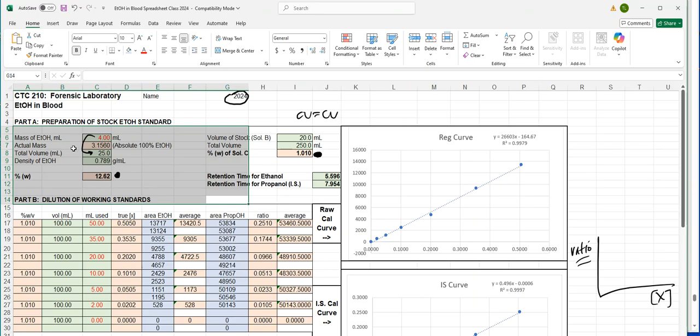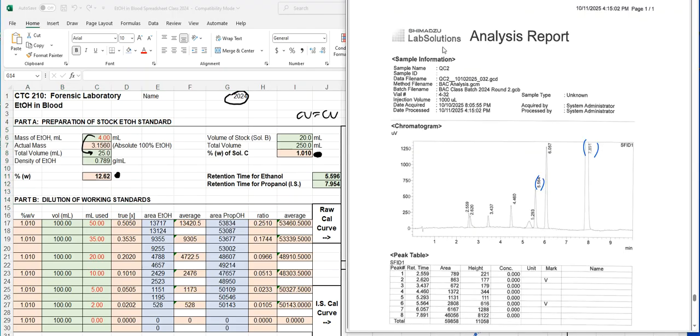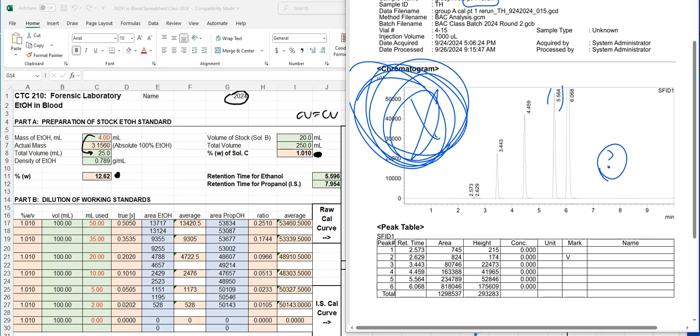There's going to be a couple of Canvas questions that you're going to have to answer that will be toward a lab grade. And then there's going to be a spreadsheet that adds on top of that that will also count toward your lab grade. So make sure that you pay attention to details. Make sure that you are running and reading these reports the proper way. Make sure you don't get cross-eyed and pretend like, oh my God, I need 5.5, but I accidentally used the 4.49 number, because that's going to set off a chain reaction that will start giving you incorrect answers all the way through the spreadsheet. So just be aware, double check all of the lab data.